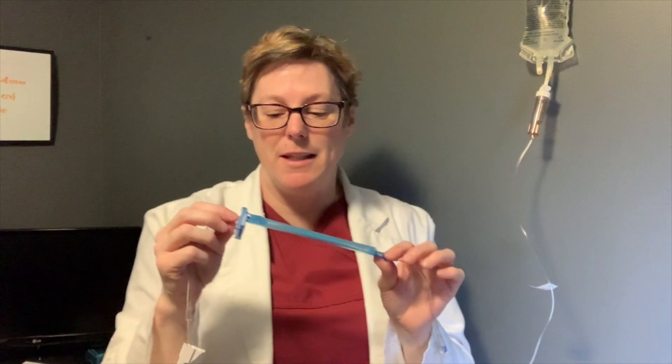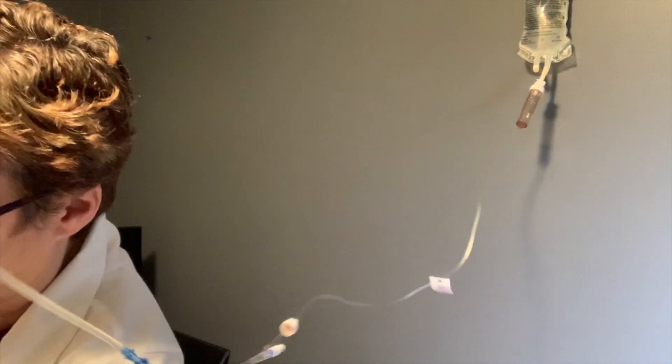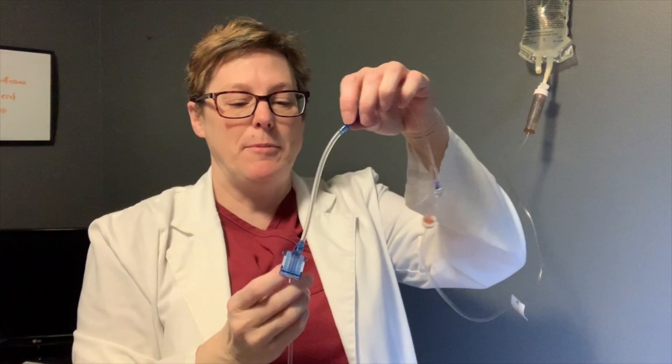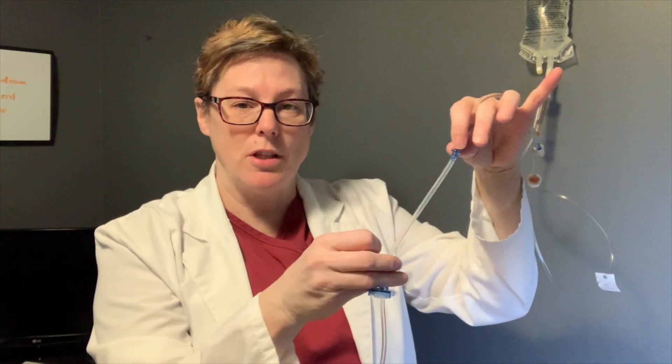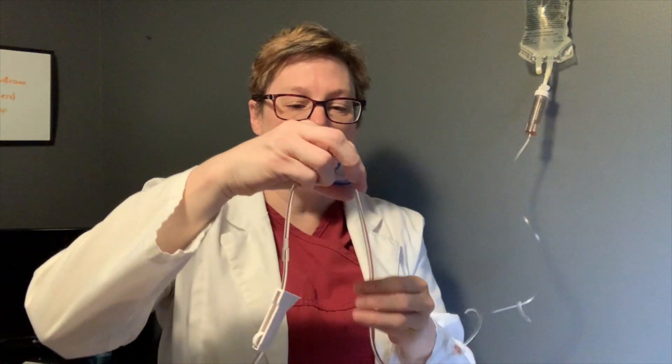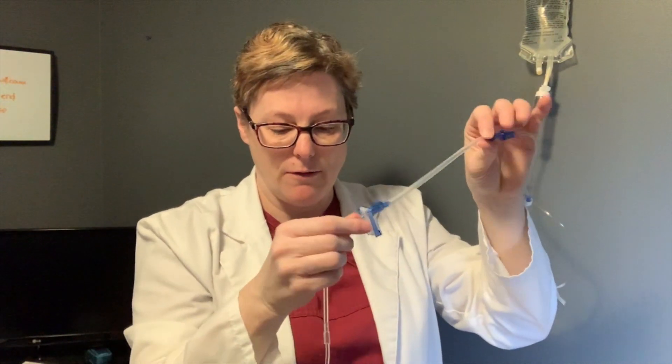With the Alaris line in particular, sometimes air bubbles get into the sheath. We're going to remove this sheath now — this is the part that sits in the Alaris pump and will beep when there are air bubbles. You can stretch it because it is stretchy, and then just flick it, because air will rise. Depending on which direction you want those air bubbles to go, just flick it and those air bubbles should clear out of the line.